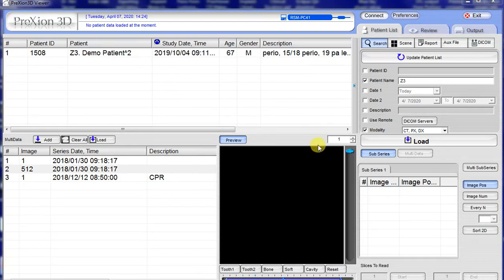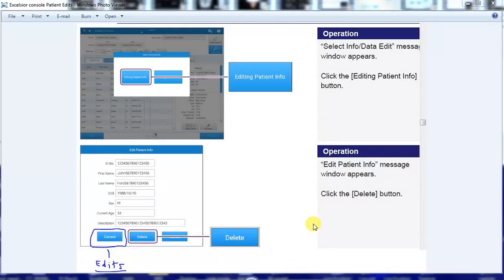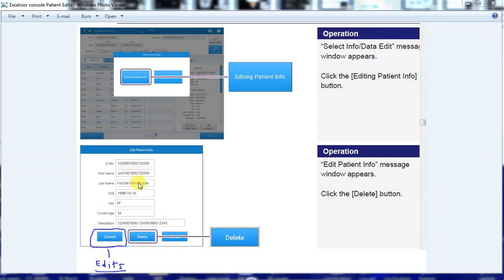Remember, you delete from the viewer software, but you have to edit from the console software — that's a little different. So if you want to edit from the Excelsior console page, go to the Excelsior console page, pick your patient, and look for the Edit Patient Info tab. It gives you a selection: you can either delete or hit Correct. When you hit Correct, provide the edits inside the fields. Once you do that, click Exit and it will save.